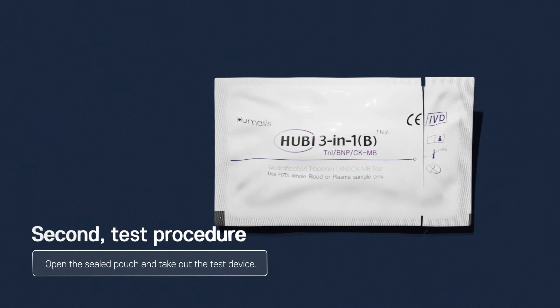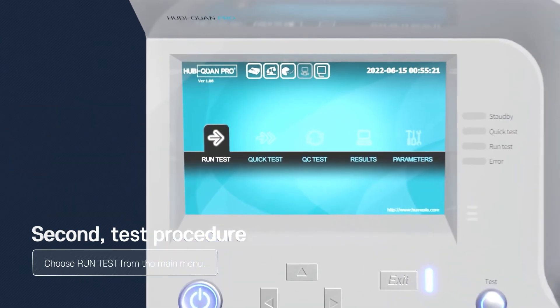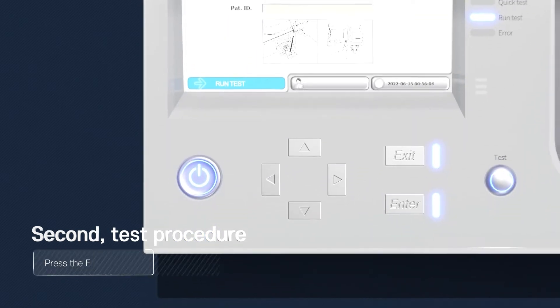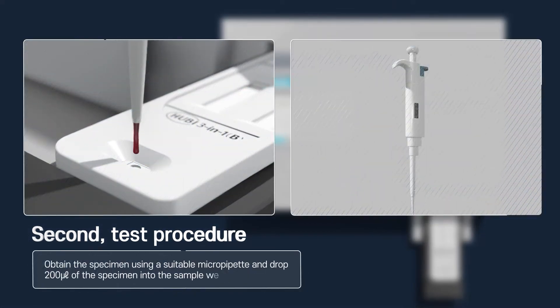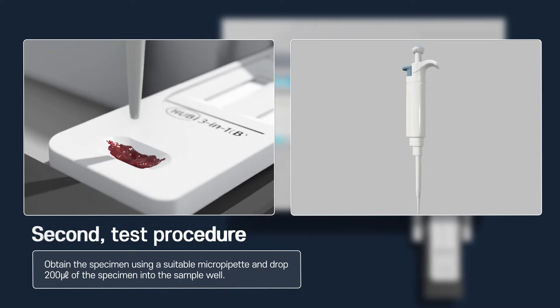Second, test procedure. Open the sealed pouch and take out the test device. Choose Run Test from the main menu and press the Enter button. Insert the kit inside when the tray opens.